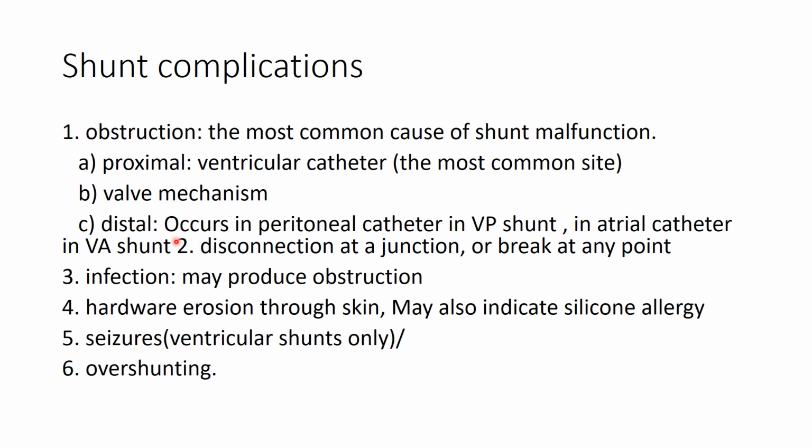The second problem is disconnection. These parts of the shunt come separately, and we connect them during surgery. So whenever the problem is disconnection, it's at the point where you connect these parts, or they might break, for example.